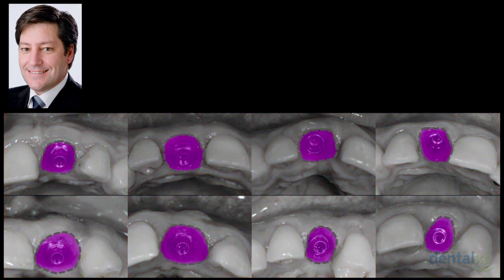And if I make abstraction of the color and I show you the outline of this emergence profile, each case is completely different. So you can't really say, oh, I'm going to use the same component or the same part for every case. It has to have some degree of customization, whether you go cement or screw retained.